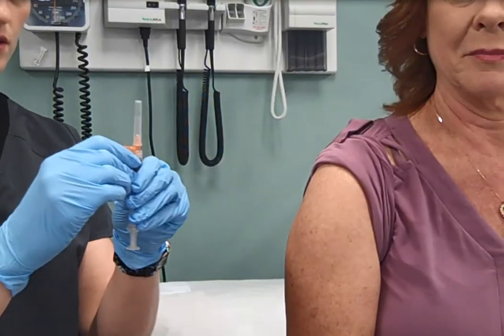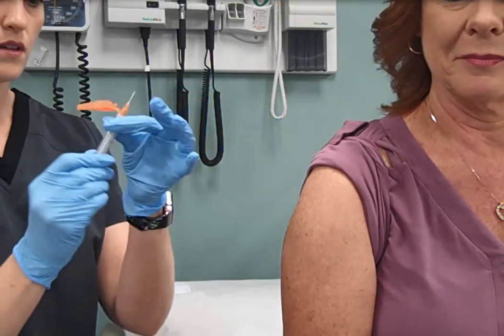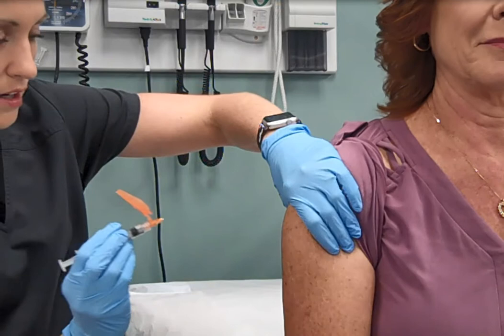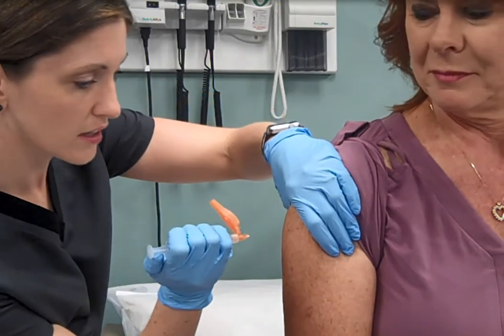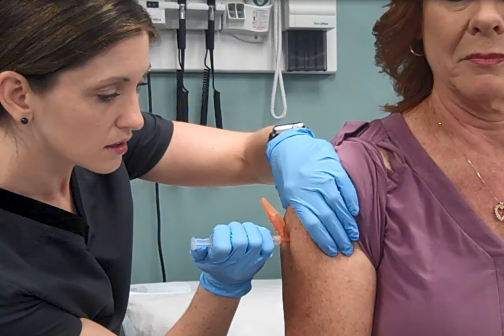Prepare the syringe and hold it securely to insert the needle at a 90 degree angle. With one hand, hold the barrel of the syringe while pulling back on the plunger slightly with the other hand to make sure a blood vessel has not been penetrated — this is known as aspirating. If no blood appears in the syringe, proceed by slowly pushing down on the plunger to expel the medication into the muscle.